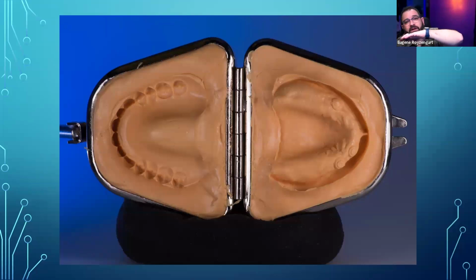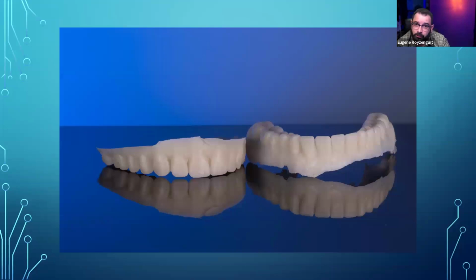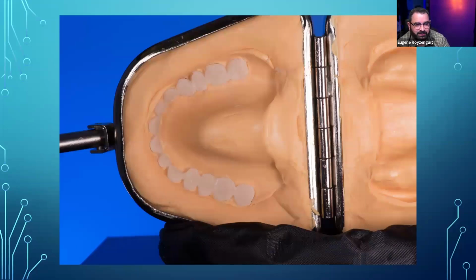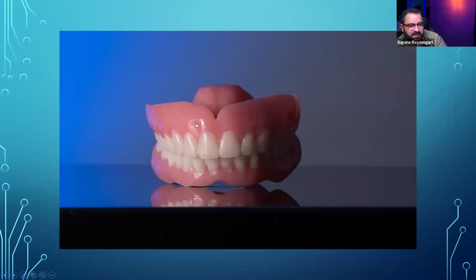Where you have pink gingiva and white teeth. Now, the way we used to do it was kind of complicated and it looked really horrible. Basically, I would duplicate the flask, do the tooth portion first, then trim everything back, place it back into the flask, and then do pink acrylic. You can see the margins were kind of crappy and it just didn't look that great. Not that they look amazing now for duplicates, but definitely a lot better than this, okay?